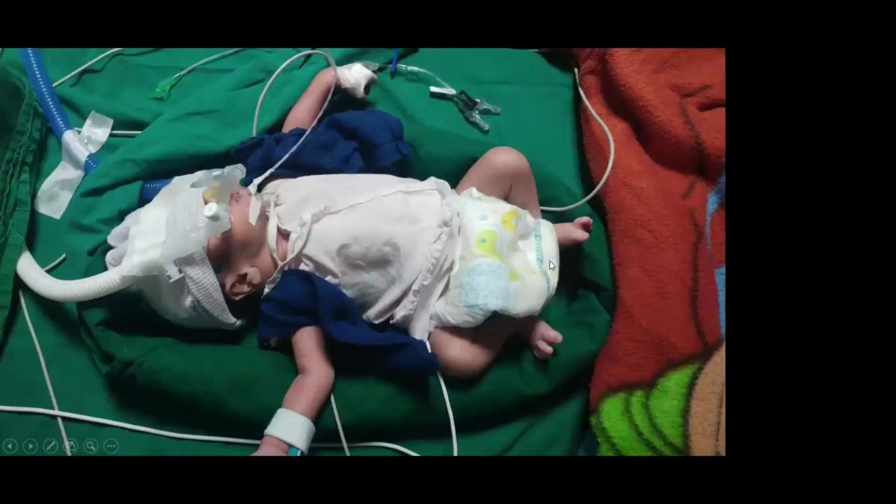So for example, I want to take an X-ray of this baby. First of all, the hands should be spread wide apart. Anything which has buttons or things like that on it should be opened. Otherwise the cloth need not be opened, but we'll open it just to see the technique. Arms should be spread sideways or maybe above, if it is possible. The baby should be centered nicely, because plenty of times, because of this bed that we make, babies can tilt a little bit here and there. So see to it that the baby is not tilted to either side.